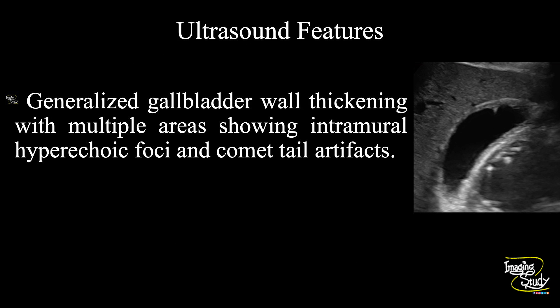So in summary, the gallbladder wall is generalized thickened with multiple focal areas showing intramural hyperechoic foci and comet-tail artifacts. Color Doppler shows twinkling artifacts also. These features conclude as a case of adenomyomatosis of the gallbladder.